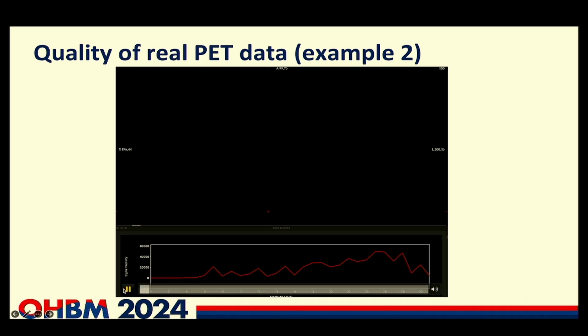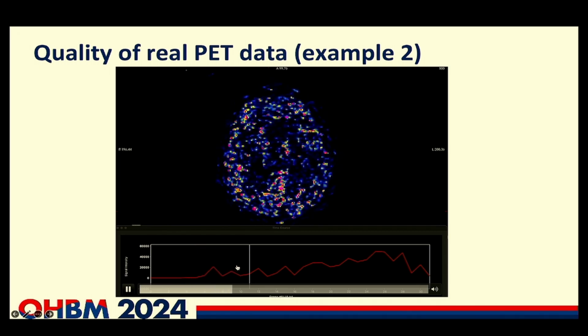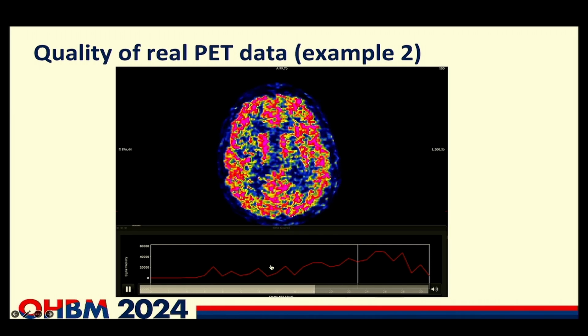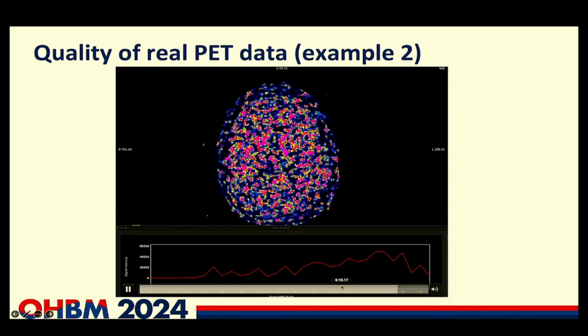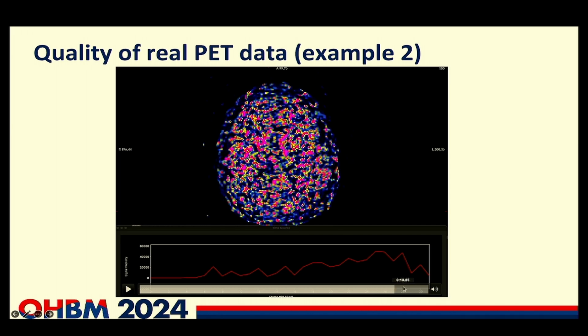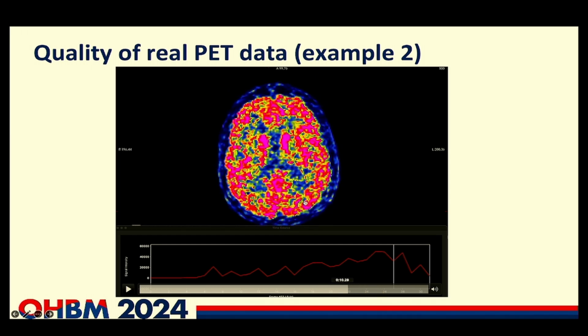All right. So this is example number 2. You also see no signal in the beginning. It accumulates over time, peaks at around here, where you get a very nice signal, and then goes back to this decaying signal again. Before, something like this was probably the best. Okay, so what are the differences between these two data sets?